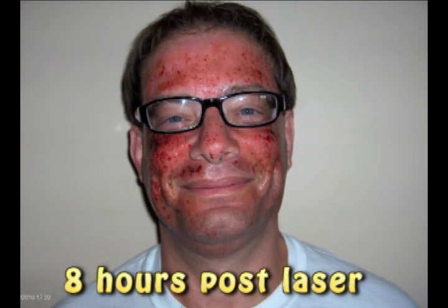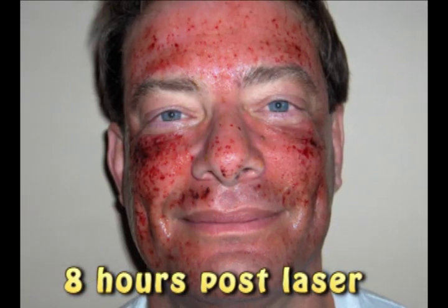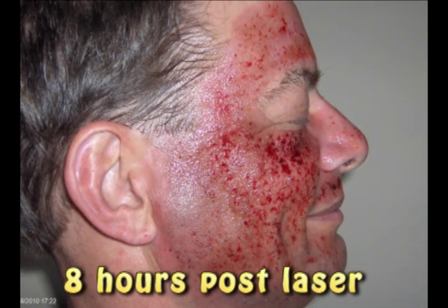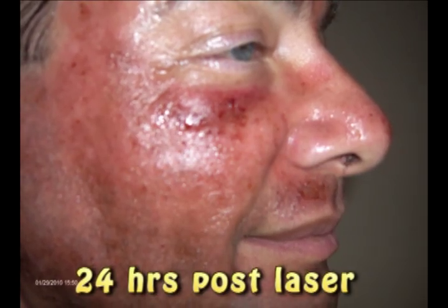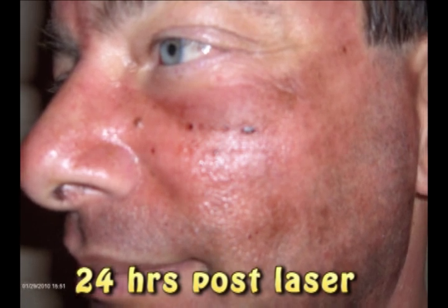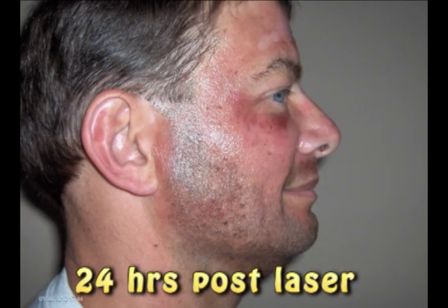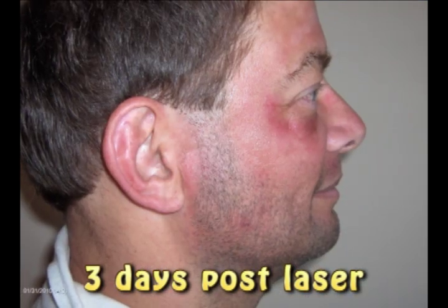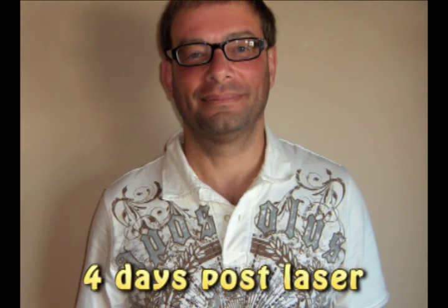The fine wrinkles around the mouth, fine lines, crow's feet — it resurfaces the entire facial area. We can go down on the neck, on the chest. It's a wonderful procedure. In one treatment, you can get great results with the erbium by targeting the fine lines and wrinkles, crow's feet around the lip area, and just blending the color of the skin. It does a wonderful job. It makes your skin baby soft, and the downtime is four days. It's ablative and it requires some care.